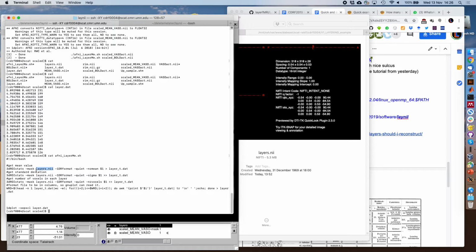Do you have any more questions? Just a quick one. Well, no, it's not a quick one. It's a discussion question, I suppose. Do you have an idea of the nominal resolution, or whatever we're going to call it? How many layers, just in the mask we just drew? What is your opinion about the number of layers that can meaningfully be disentangled? It's a question that I should ask you. I think you thought about these partial volume effects much more.